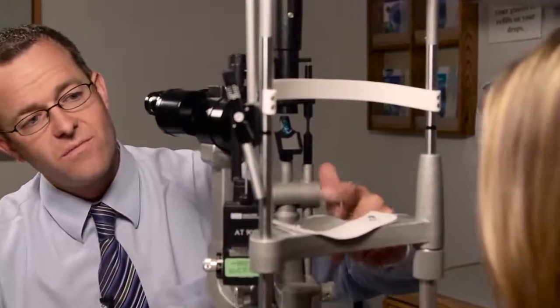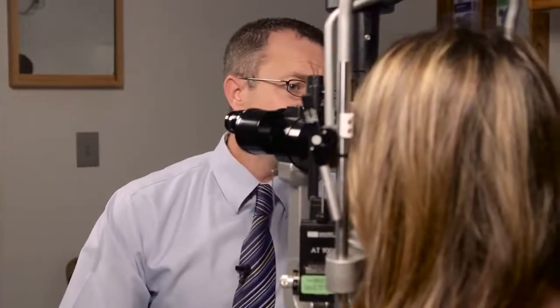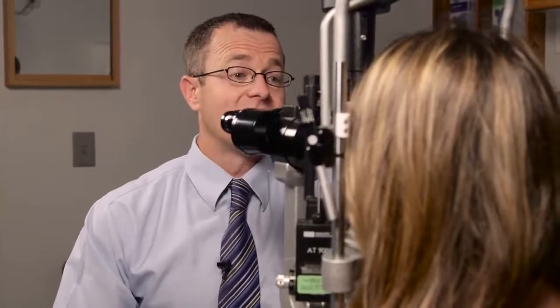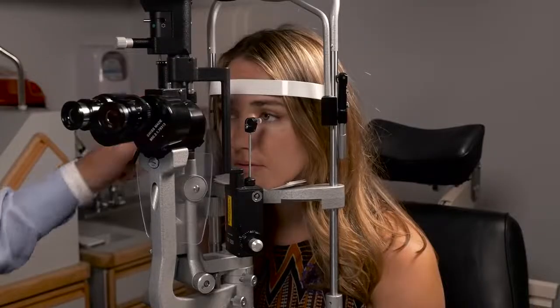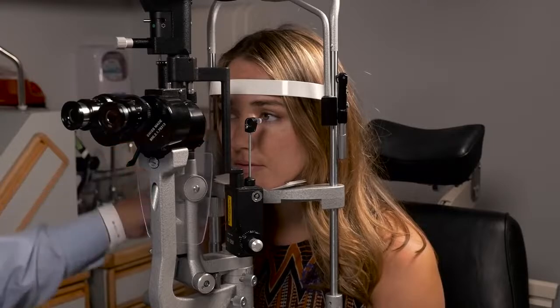So you ask them to please come forward here, chin down in here, forehead up against the headrest. It's important they try to keep their head up against the headrest. You don't have to hound it too much. It's not the end of the world. And then I'm looking, you can't see it right now, but I'm currently looking at that black mark on the right side, and I'm looking at the patient's lateral canthus, and I'm going to make sure it's lined up.